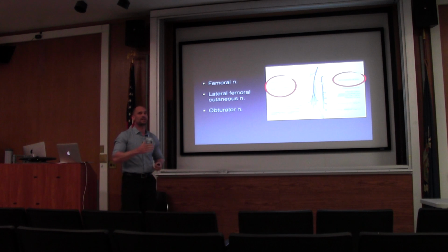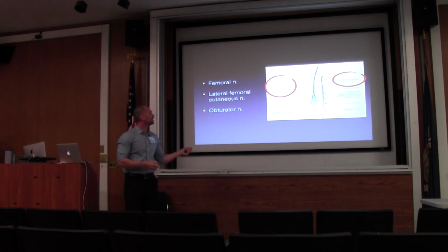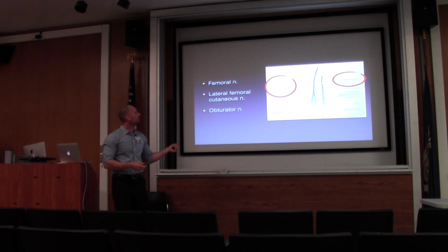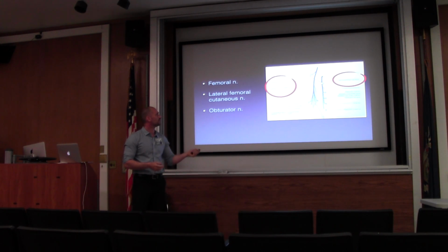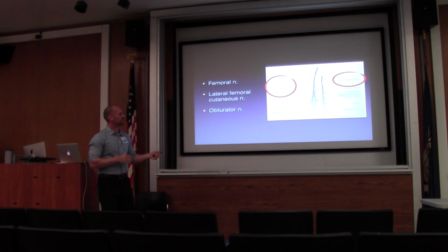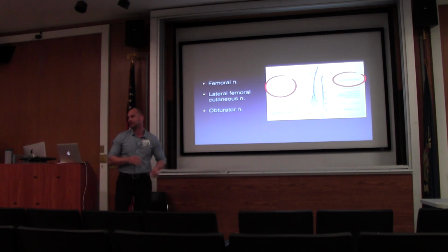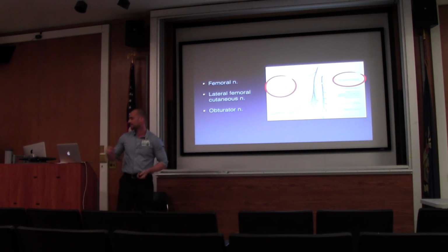So your patients may not have complete elimination of their pain. Typically, you'll get almost 100% block of the femoral nerve. About 80 to 90% of the time you'll get block of the lateral femoral cutaneous nerve. And then very irregularly you'll get block of the obturator nerve, essentially as your lidocaine extends proximally and ends up anesthetizing the lumbar plexus.